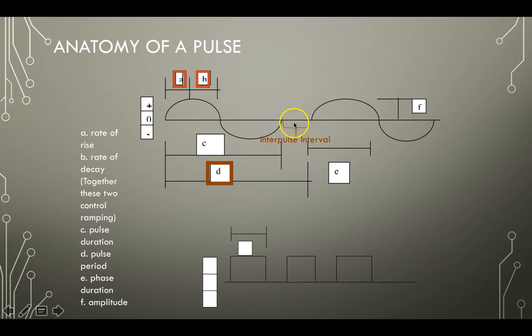We won't really mess with this. What we would set would be a duty cycle, which would be this pulse happening many, many times over 10 seconds, and then the entire current gets shut off for 50. But when we talk pulse period, we talk about the pulse duration plus this interpulse interval. So in monophasic, where the phase and the pulse are the same, our pulse period would be the pulse or phase duration plus this interpulse interval.